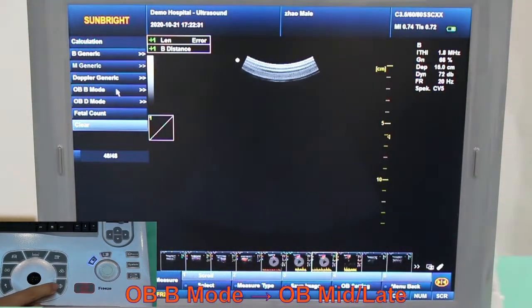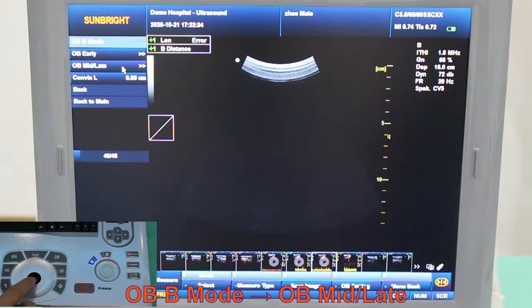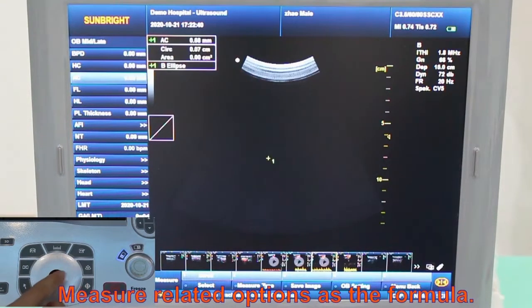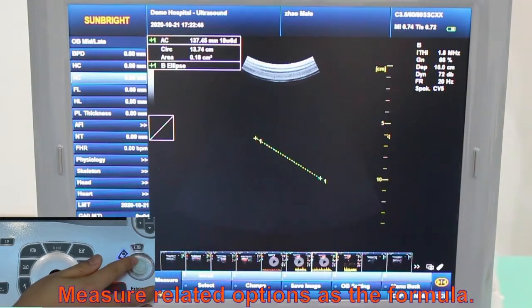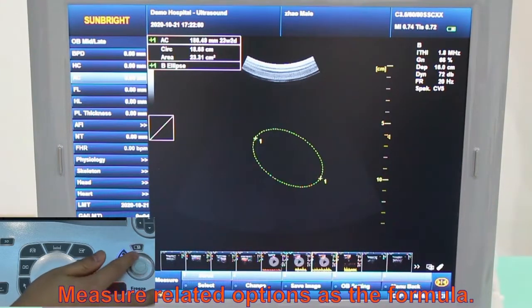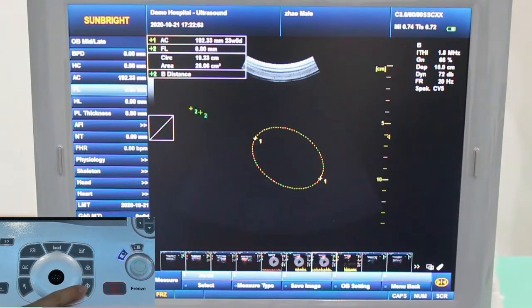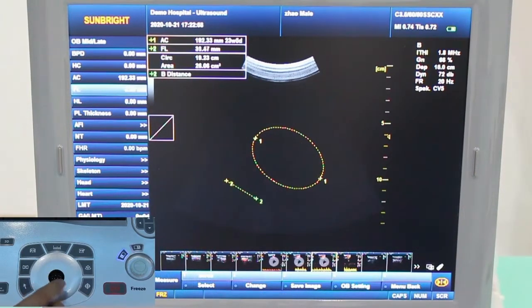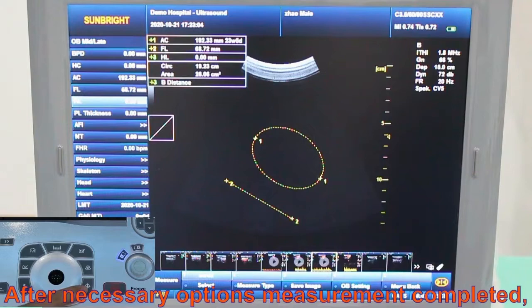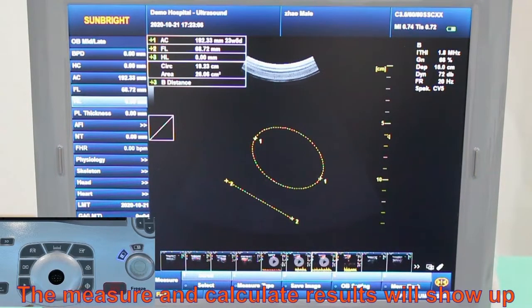Choose OB B-mode, then choose OB middle and late. Measure AC, and you can press P2 to change the measure type. Measure FL. Results are displayed on the side of the screen, such as GA, EDD, and EFW.